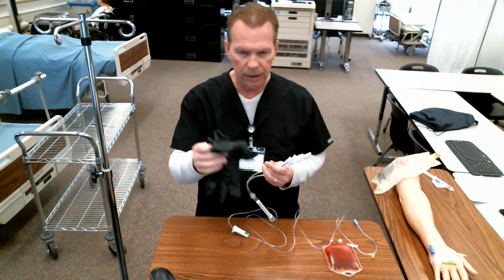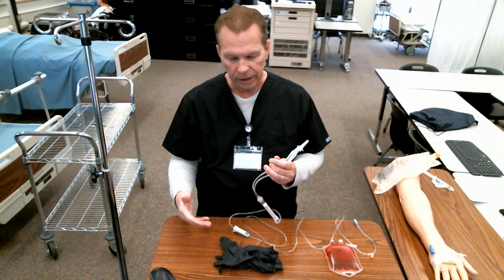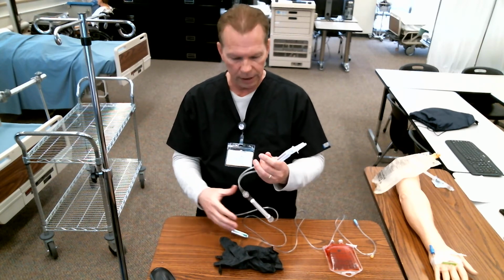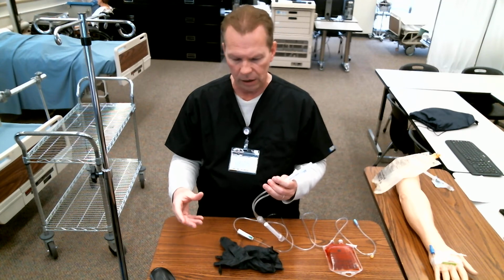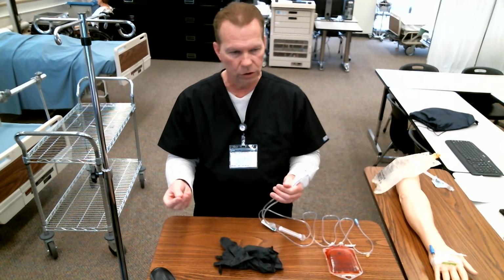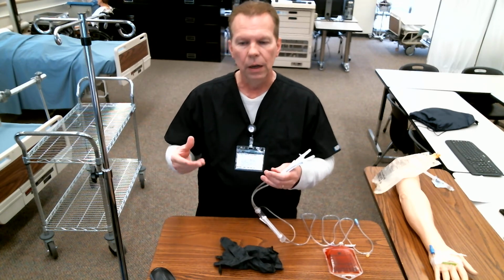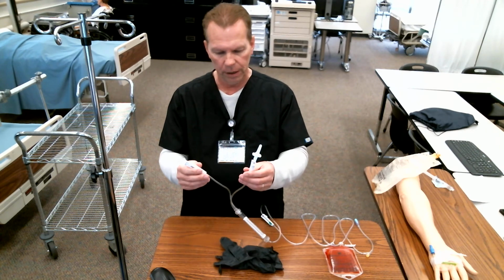You will also need a pair of gloves for when you spike the blood. You know, the rule says if there's the potential for you to come in contact with blood or body fluid, that you need appropriate PPE on. And there is that potential when we spike the blood, that blood could squirt out, something could go wrong, and we could get some blood on us. So we're going to take appropriate precautions.